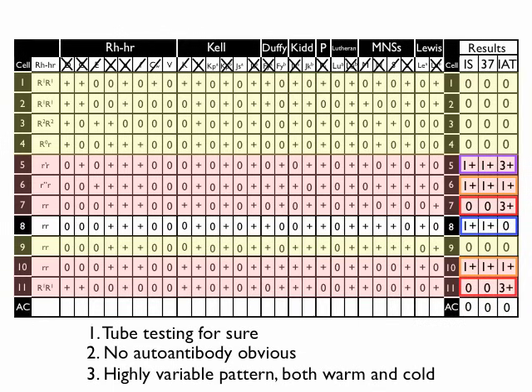So I will look at the antibody specificities that I know tend to react at AHG, and we already talked about that at the beginning. We also mentioned that the cold reacting ones, the ones that react best at immediate spin, are these up at the top left: Lewis A, Lewis B, M, N, and P. So it's probably not any of those reacting at AHG. So all we have left, if you ignore the KPAs and JSAs and stuff, you're left basically with Duffy B, FYB, and JKB as those potential quote-unquote warm antibody specificities. And let's see if either one of those fits perfectly.